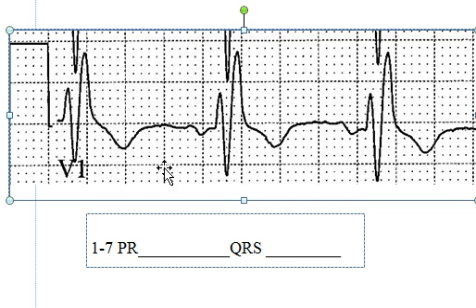make this any bigger. You see that this P wave starts by going up and then goes down. This is called a biphasic P wave, meaning it has two parts, like a bicycle, two parts. This is common in this particular camera angle with the lead setup that we put on this person. This lead is set a little bit to the right of the heart on the person's body, and so sometimes we get funky P waves, something that we'll talk about at another time.